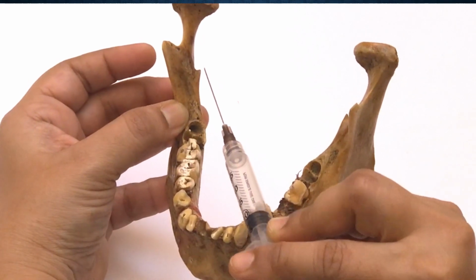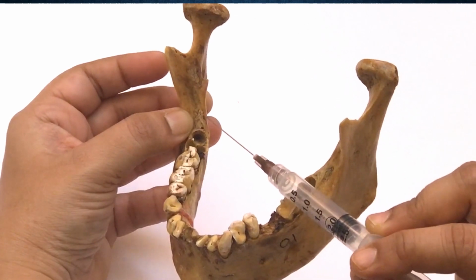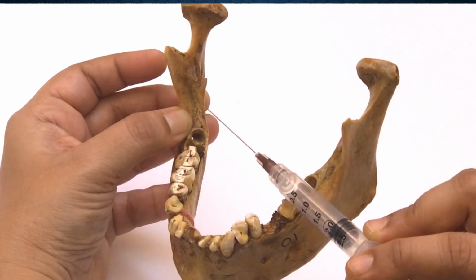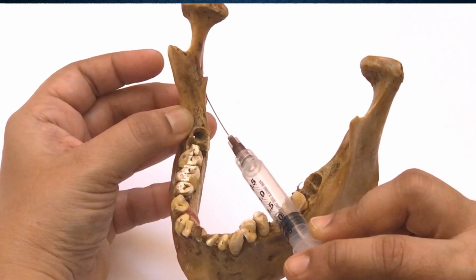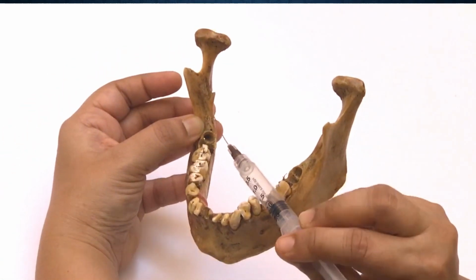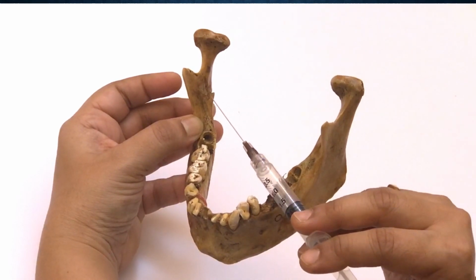If we approach the mandibular foramen from the anterior region, we do not feel any bony resistance. And if we approach it from the molar region, we see that we contact the bone too early on the internal oblique ridge, which is also not accurate. So going from the opposite side premolar is the only way to reach the mandibular foramen.